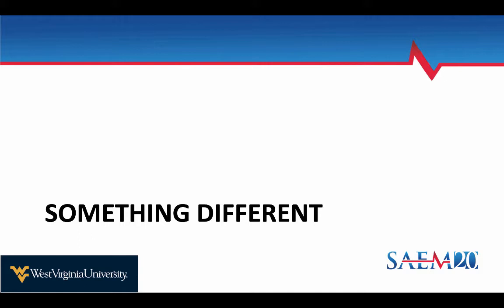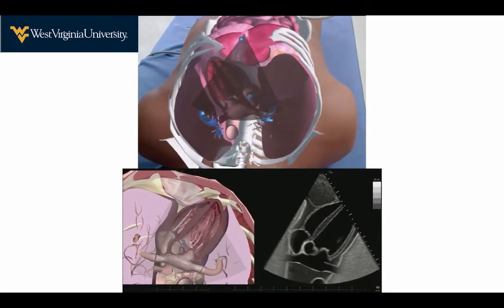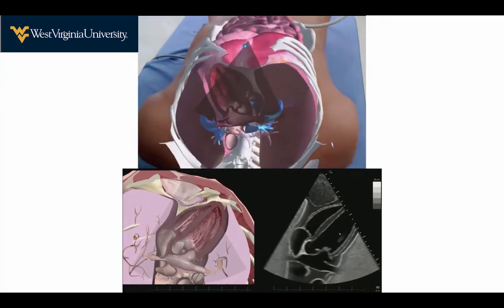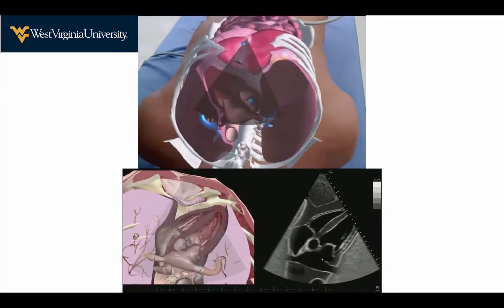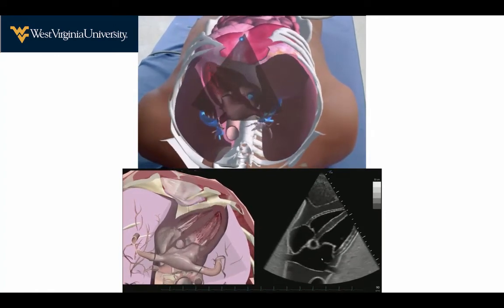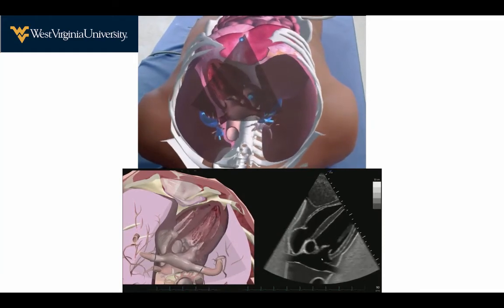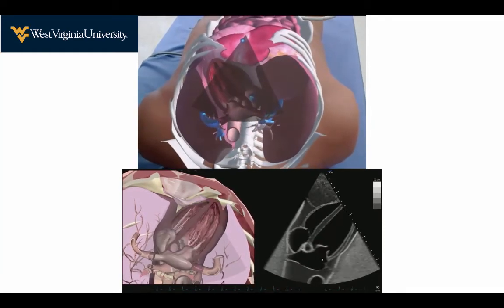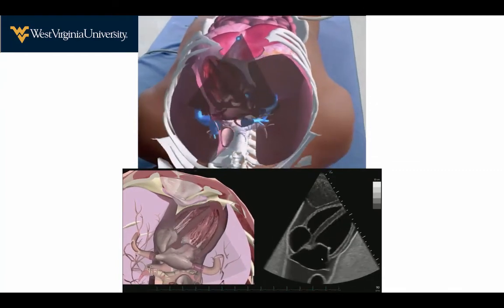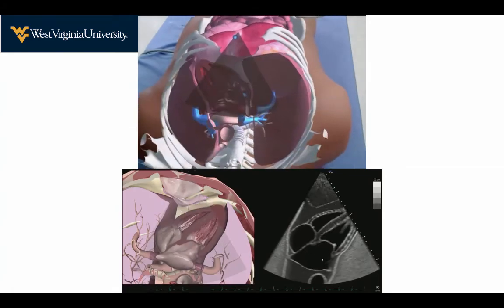And we were fortunate enough to incorporate some technology that would allow us to do things a little bit differently. And so we're going to talk a little bit through what we used, this is the Vimedix product. Again, they're not endorsing us. We're not endorsing this product necessarily itself, but a platform. And there are others out there that offer an augmented reality solution to help new learners better grasp ultrasound anatomy, especially the multiplanar anatomy of echocardiography.